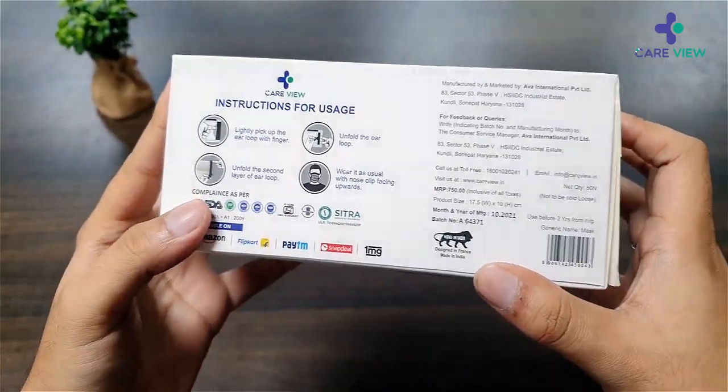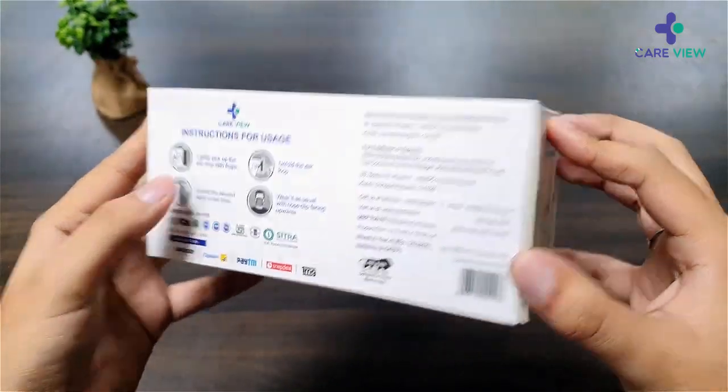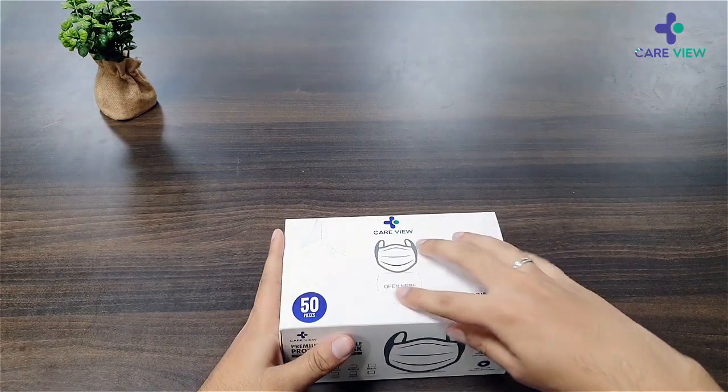It's made in India, which is a very nice thing. I would also suggest checking the manufacturing date on your mask when you get yours. Let's get it out of the box.